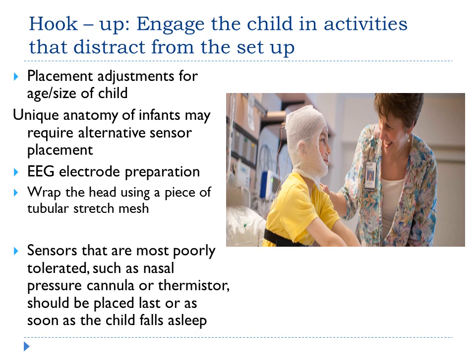Wrapping should not be excessive, as that can create some undesirable effects, such as sweating and electrode popping, and then you're just creating more work for yourself. But this mesh material does allow better air circulation, and it keeps their head cooler, and you can see how they made this one into just a little bit of a mask, so it just fits over their head nicely. You can also see they ponytail the electrodes, which most of us do with our adult patients anyway, but that does help prevent getting tangles and whatnot.